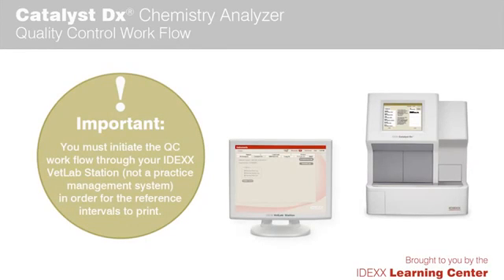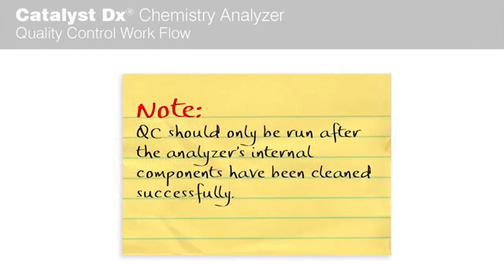You must initiate the QC workflow through your IDEXX VetLab Station, which is not a practice management system, in order for the reference intervals to print. QC should only be run after the analyzer's internal components have been cleaned successfully.